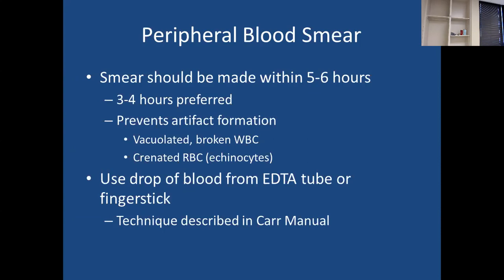They're going to start having a little curvy edge. Your white cells might start to have vacuoles. Remember I said the monocytes will start appearing more vacuolated than they should, which might make you think you have a phagocytosis process going when in fact it was just an artifact of the specimen sitting too long. As you go through topics, you will think about the time from collection to when testing should be performed. It's very important as laboratory professionals because that affects the quality of testing that we report out. So you always want to make sure of time and temperature of storage.